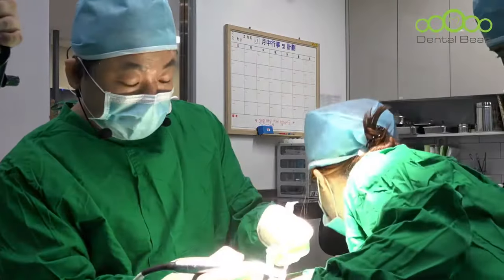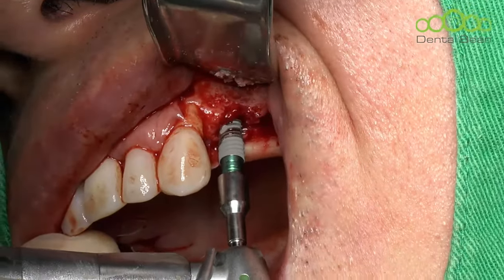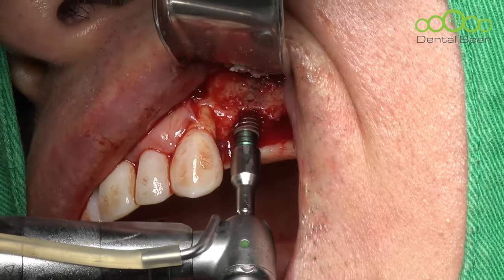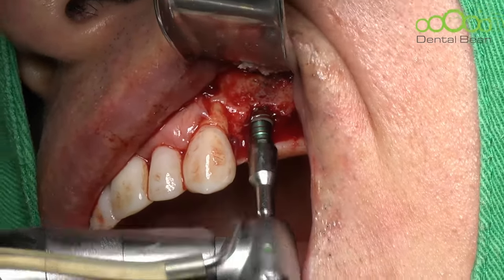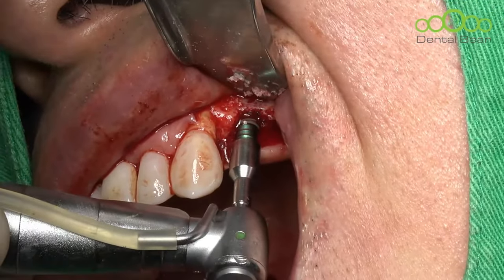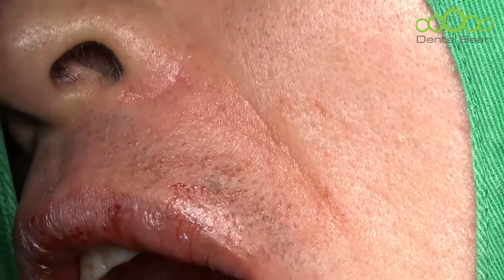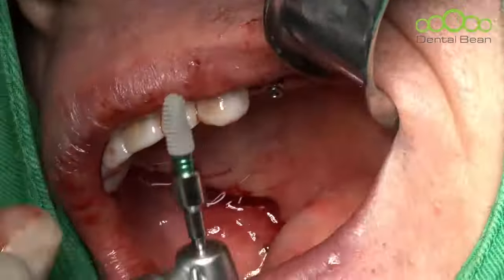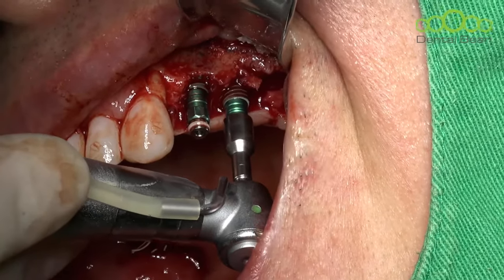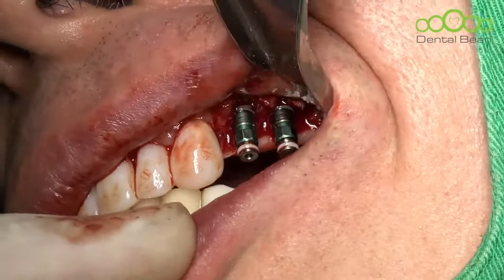Turn to the right side. 4x10 here. Torque. Very strong. 17. Good. Very strong primary stability. And the second implant, same 4x10. Okay, position not bad. Next, please look this way. Close, please. Okay, slight buckle, no problem.